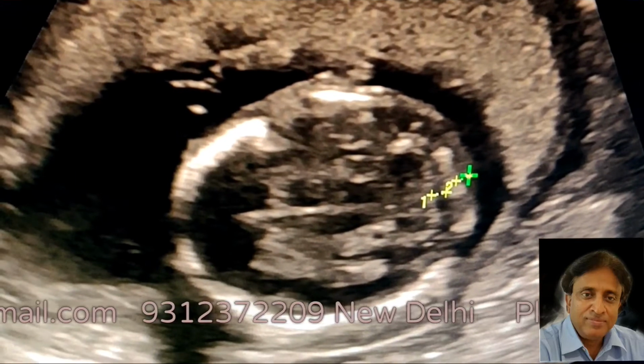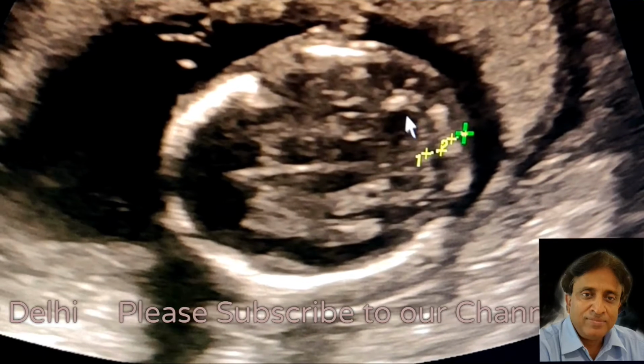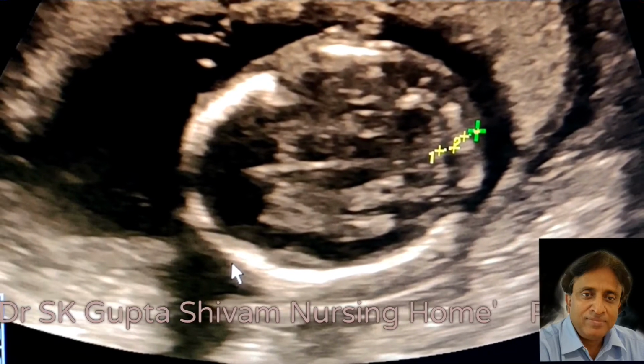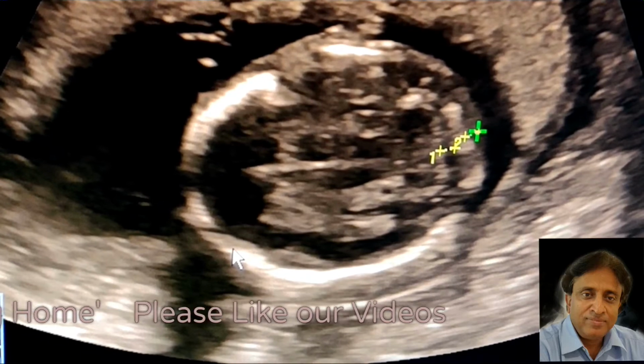This is the posterior fossa, and you can see that the cisterna magna is normal. This is the cerebellum, which appears to be normal. The nuchal fold thickness also appears to be normal. There is no banana sign, and it appears that there is no leakage of the CSF. So the AFI in this patient was found to be normal.